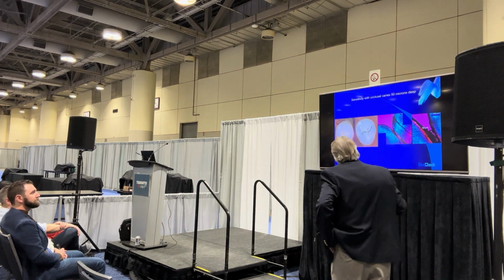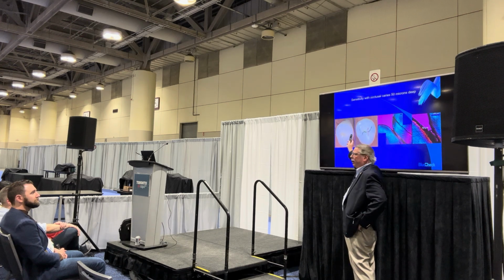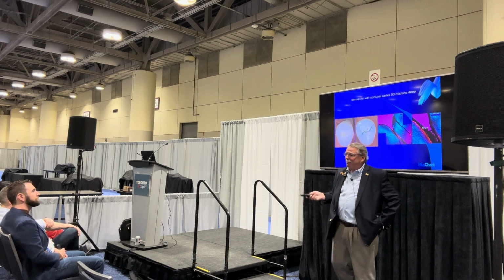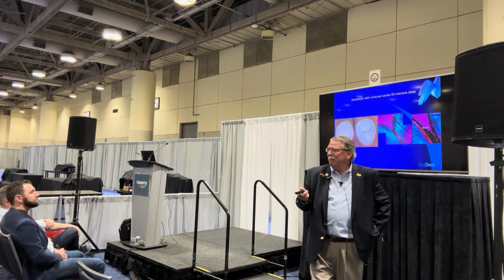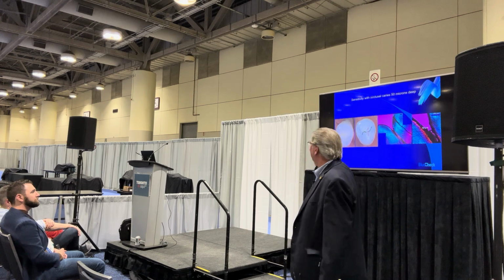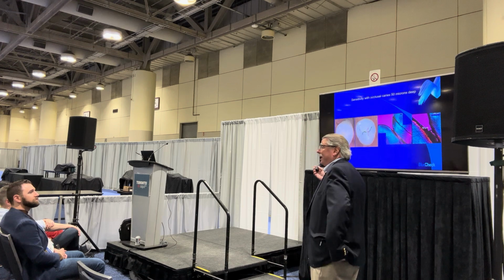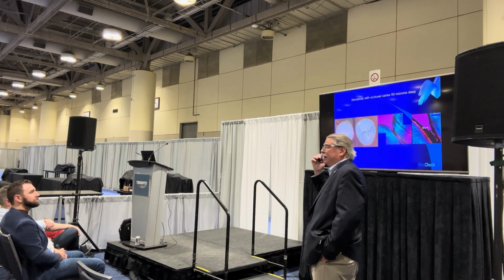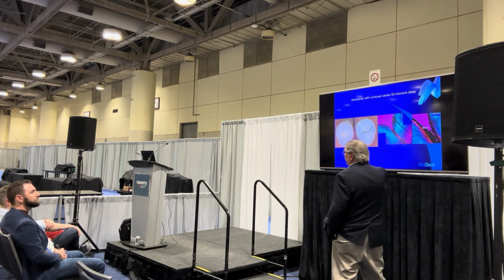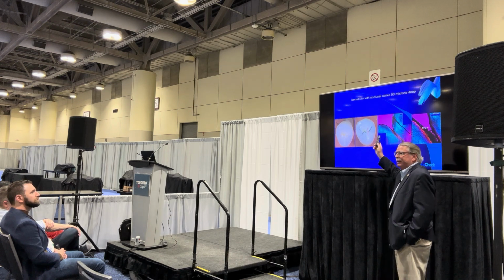So, the sensitivity with occlusal caries at 50 microns deep. Again, you really can't see that well. I know you as pediatric dentists, you see it. You can see that opaqueness right there. But I'm telling you, a parent cannot see that. If you're sitting there with a mirror and you show the parent, even if you have a camera system, I'm telling you, they don't see that well. But you stick a dye on there, oh, they can see it. They can see it crystal clear. Take a picture in case your insurance company goes through these spastic reviews that they do now and then, and you got proof. And this is what it looks like under polarized light microscopy.